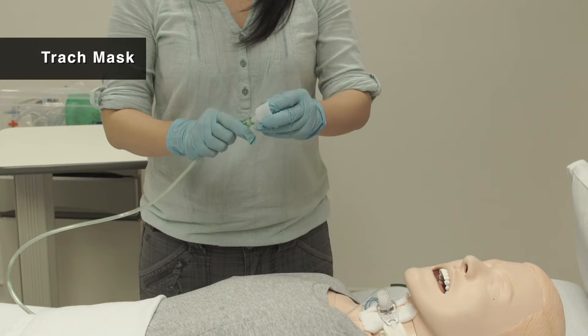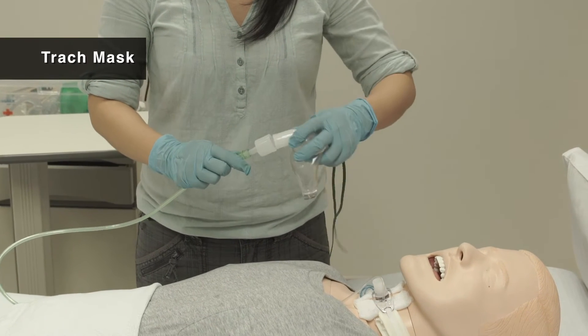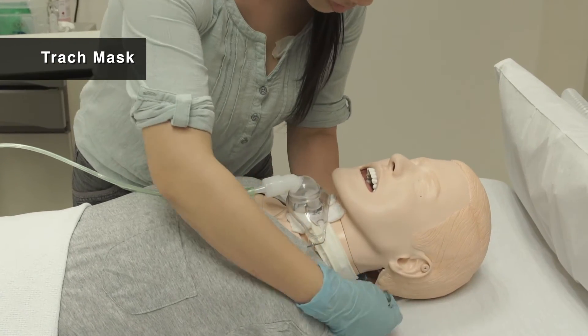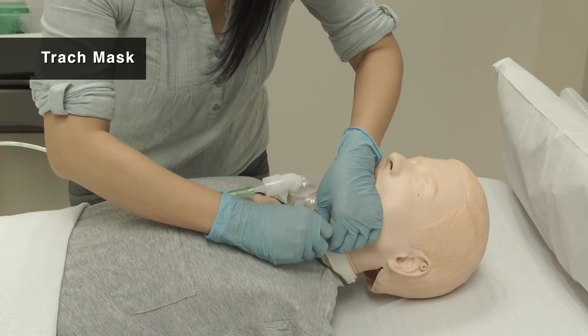When not using the ventilator, connect the oxygen tube to the adapter and trach mask. Apply the mask by covering the tube and secure it by tightening the strap around the patient's neck.